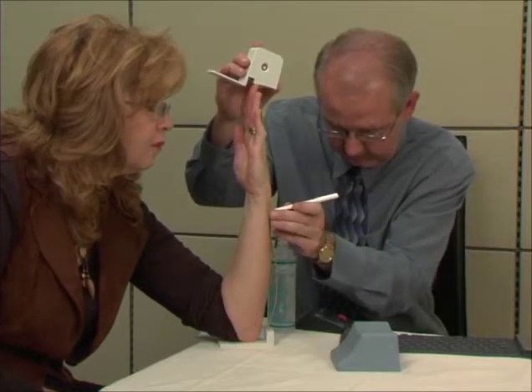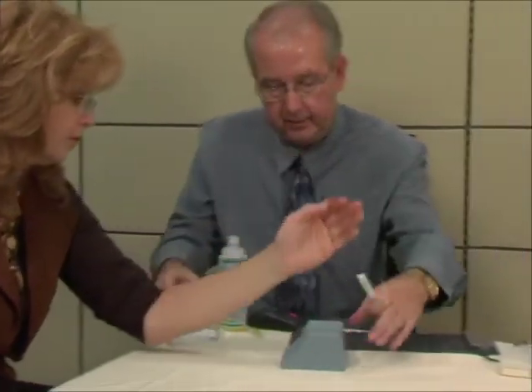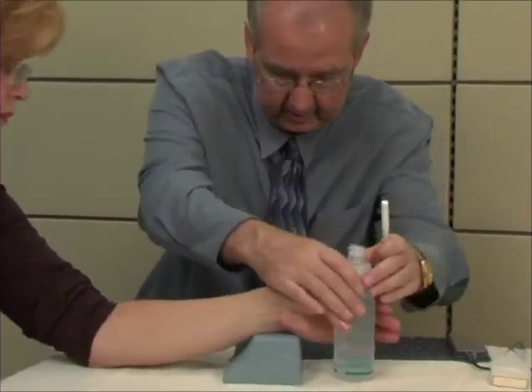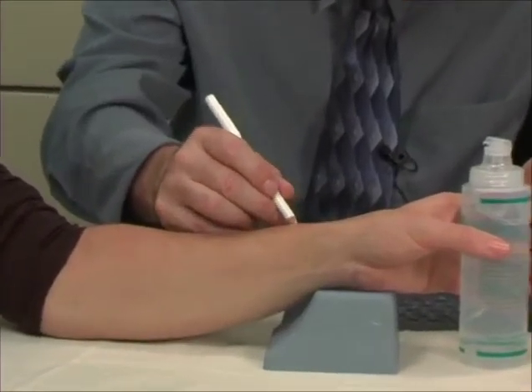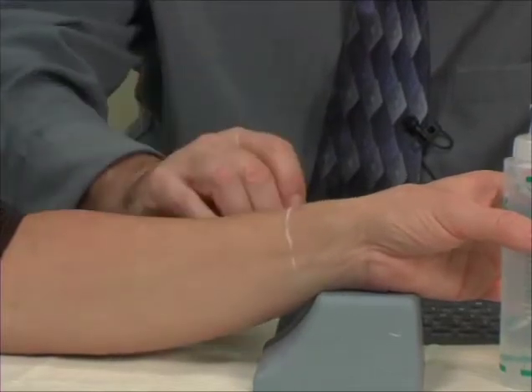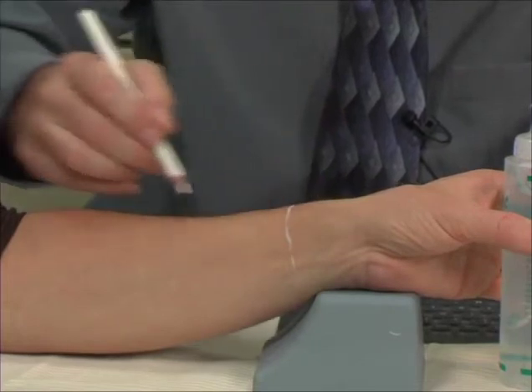And I'll try to do it lightly. Now if you'll just put your arm down on top of this rest and maybe hold on to this bottle for me. That's great. With your arm away from me, I'm just going to extend that line around your wrist. And that's going to give me an area from which to measure, because your radial bone actually runs up from your wrist right up to your elbow.